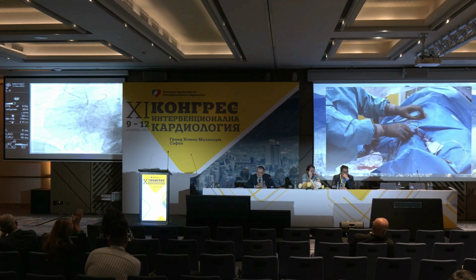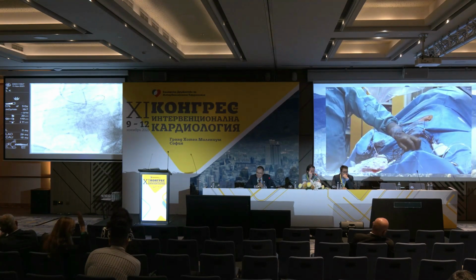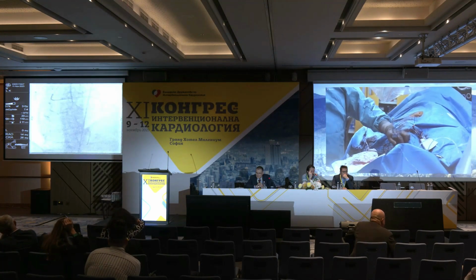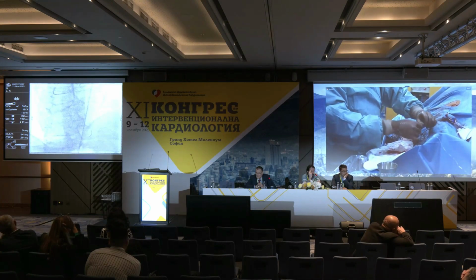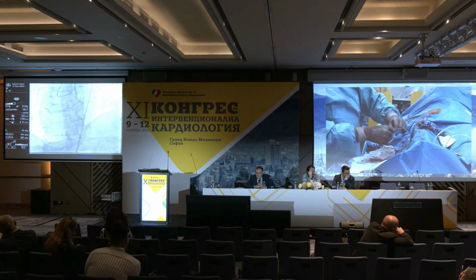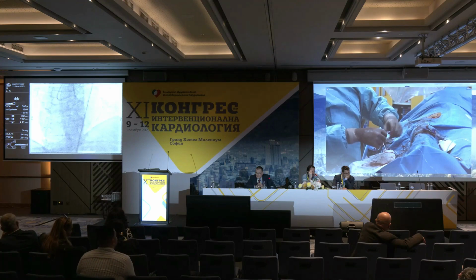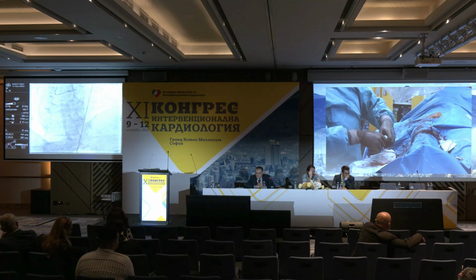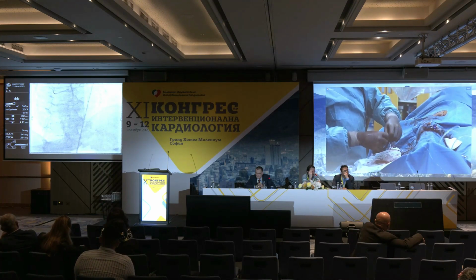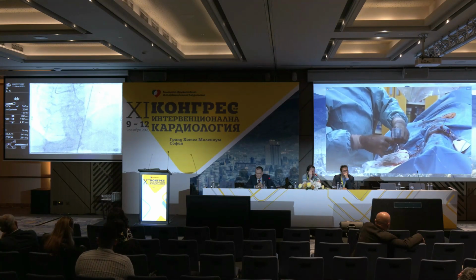Now, one thing: my retrograde microcatheter is a little bit deep into the septal part. So what I'm going to do is retrieve it while keeping the retrograde wire. We're going to make a tip injection there. You see, I do it by rotation. I don't force the guiding catheter; the antegrade remains stable. We just want to control the collateral. Be careful at this time point that you don't take back your retrograde wire, because you can slice the septum. I think that's enough.